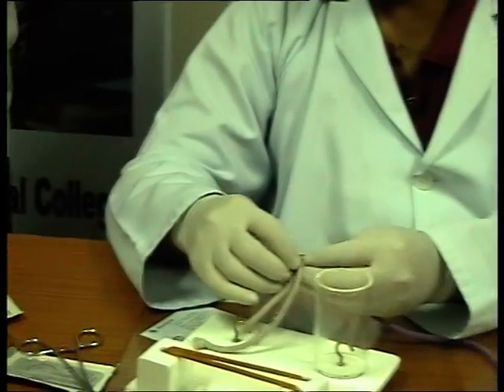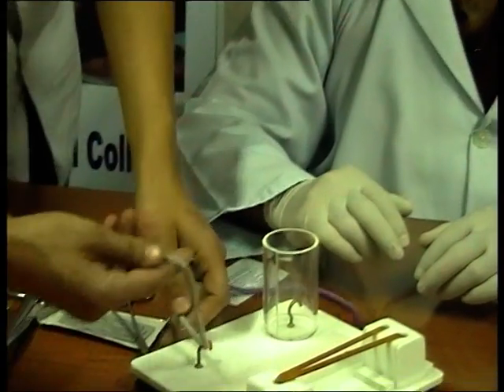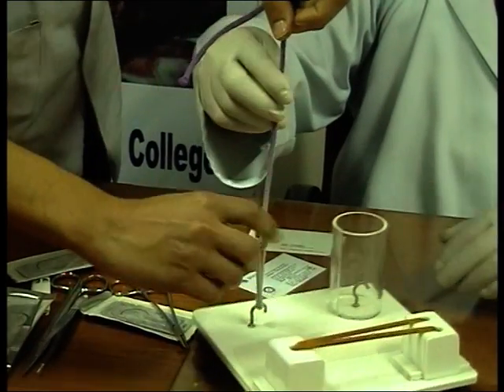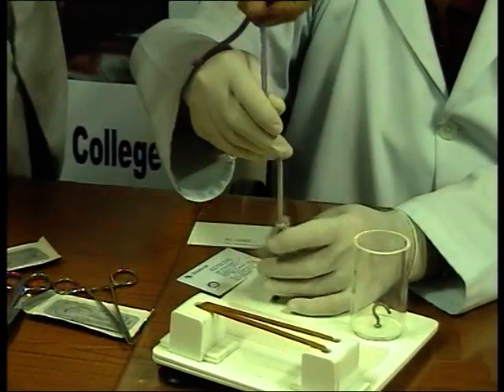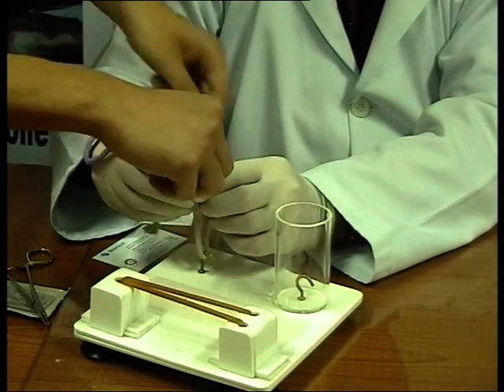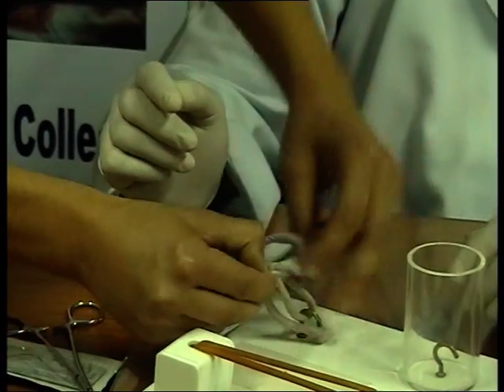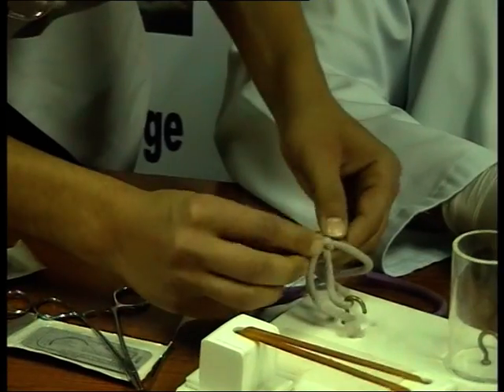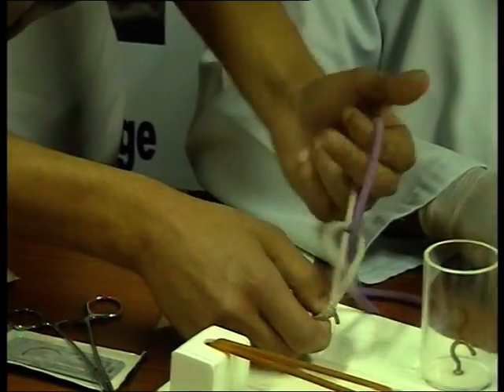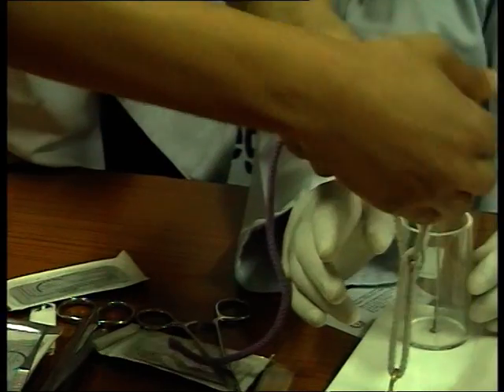Can you put it now? Keep it straight. Otherwise it won't slip, unless you keep it straight. It's not the kind of thread you use in surgery, so it gets stuck. Keep the ends long and straight. Unless you keep it straight, it slides. Take it out. Keep one end straight. That's important. Don't cross, yes. Middle. Yeah, middle. Right.